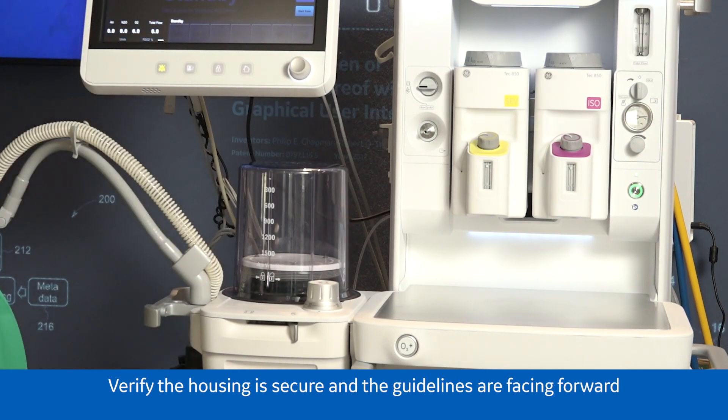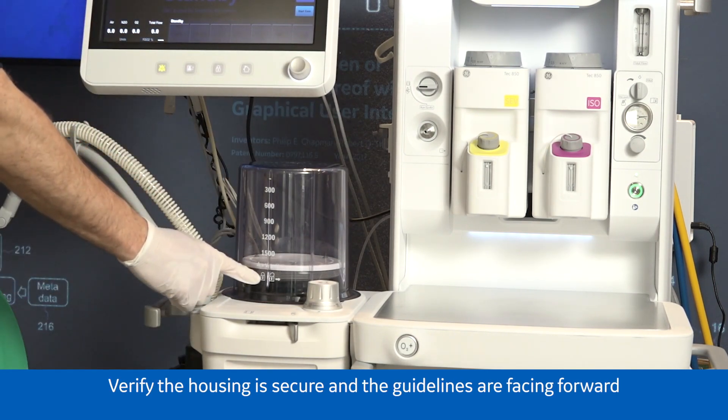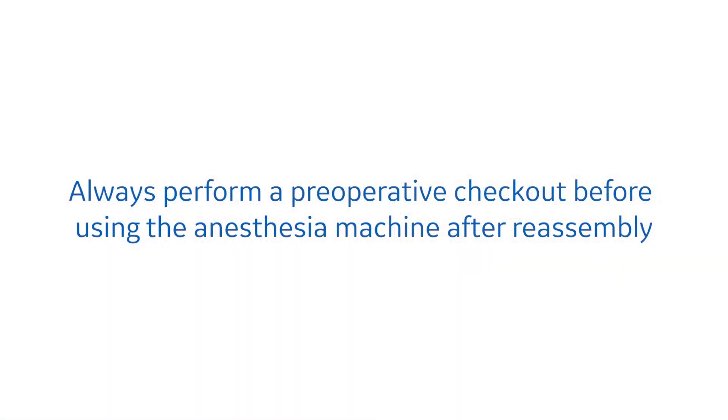Verify the housing is secure and the guidelines are facing forward. Always perform a preoperative checkout before using the anesthesia machine after reassembly.